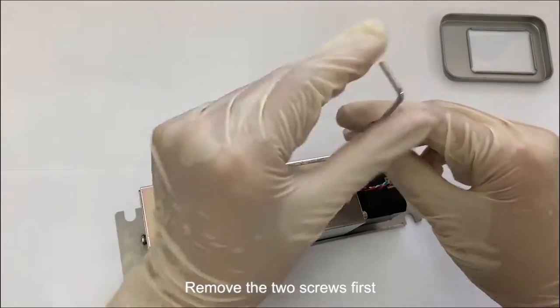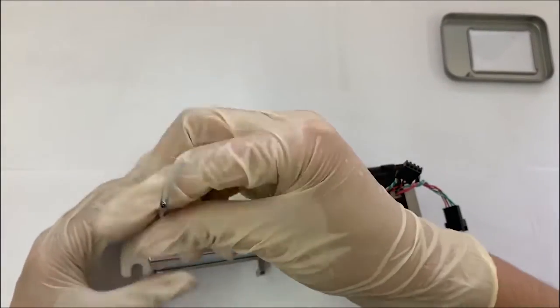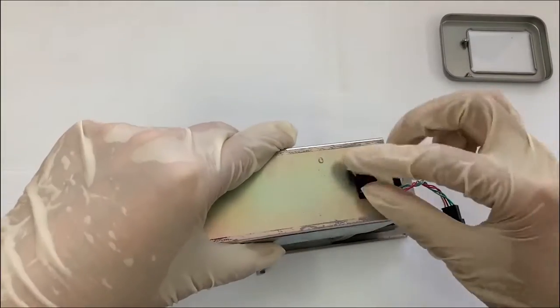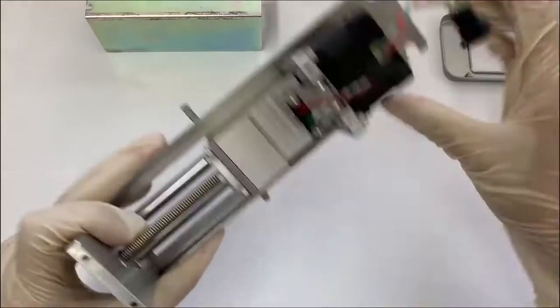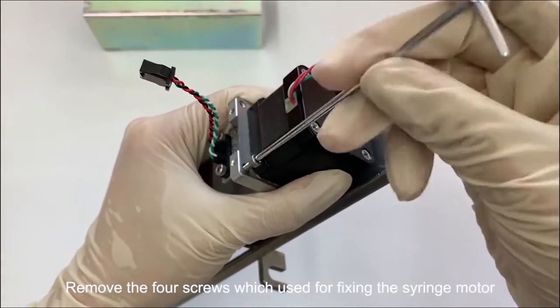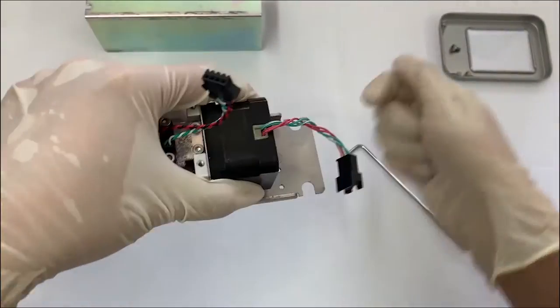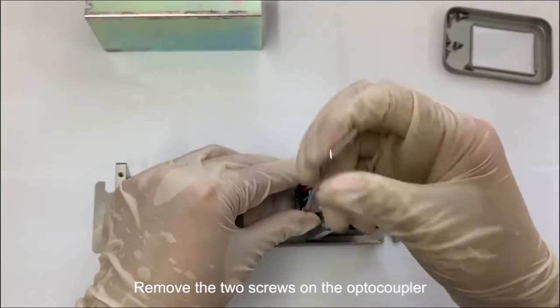Remove the two screws first. Remove the four screws which are used for fixing the syringe motor. Remove the two screws on the optocoupler.